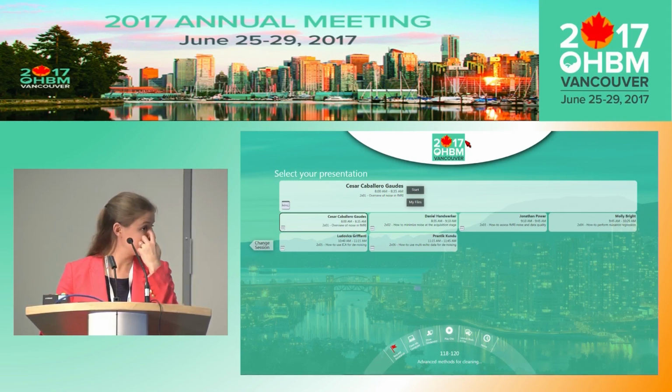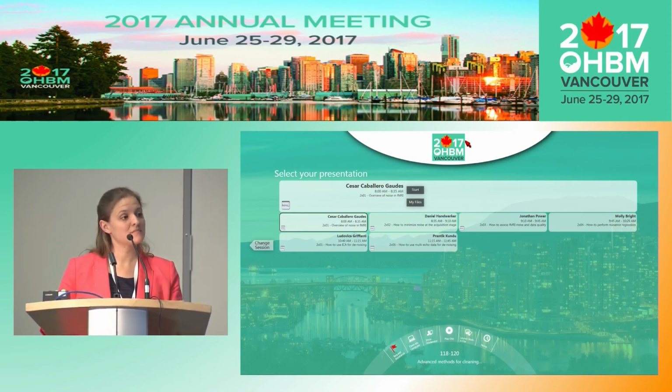They will be differential between groups, and you'll get a group effect, and it'll be because of artifacts. So the literature right now is rife with artificially inflated group effects because of not paying attention to this. I think if there's a take-home message to this whole session, it's that we need collectively to be very critical of all of our denoising approaches, so that what you're saying is not true in the future, and we do understand what denoising is appropriate.